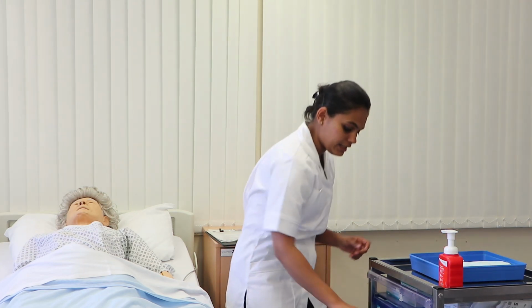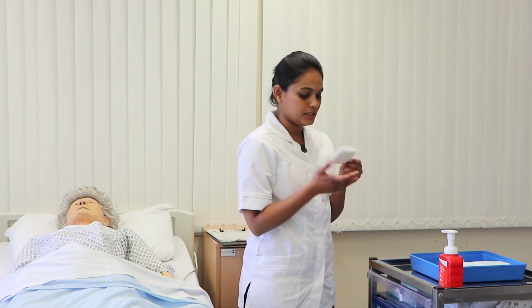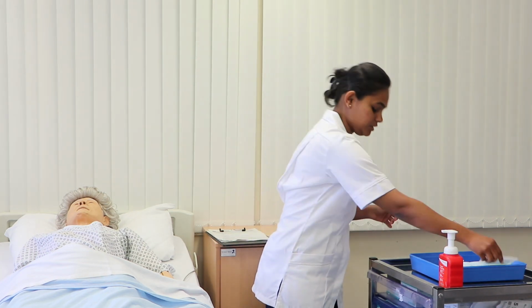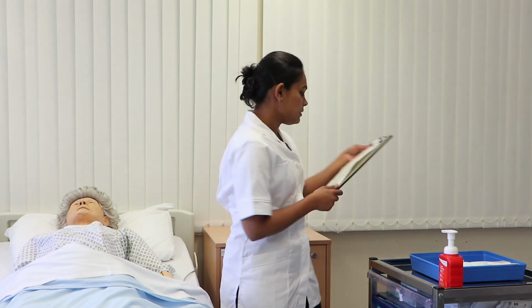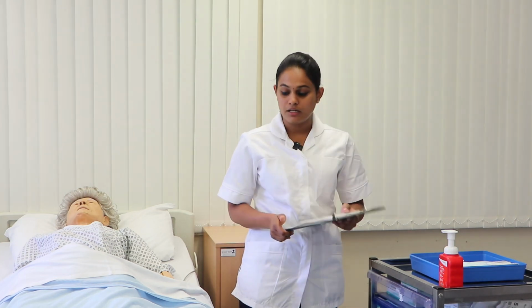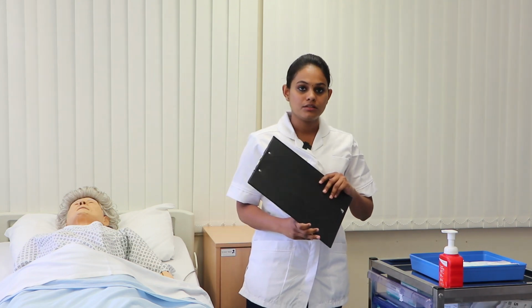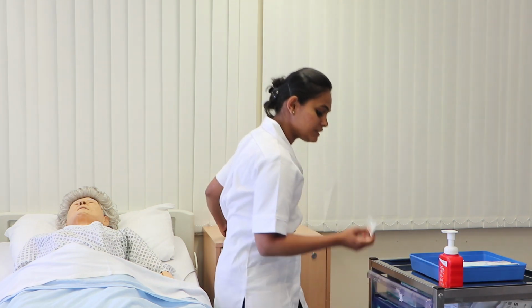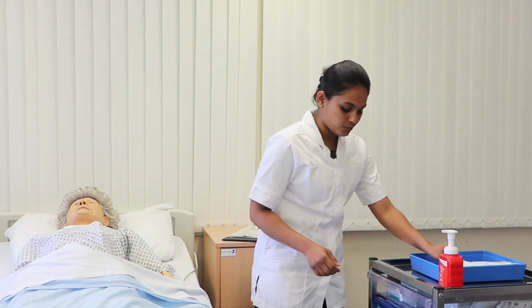Okay, and I need a gauze which is clean, dry, and intact, and not passing the expiry date of 2027. It is safe for me to use. And I will check the documentation for seeing how many ml of sterile water was used for inflating the balloon. And Assessor, can I confirm it? 10 ml. Okay, I need a 10 ml syringe which is clean, dry, and not passing the expiry date of 2027. It is safe for me to use.